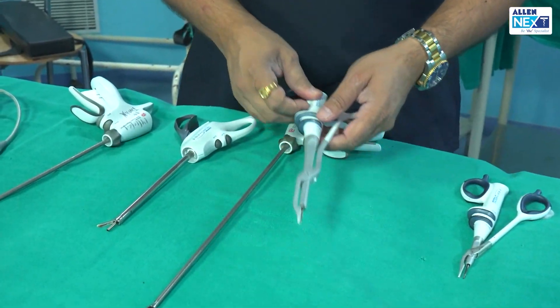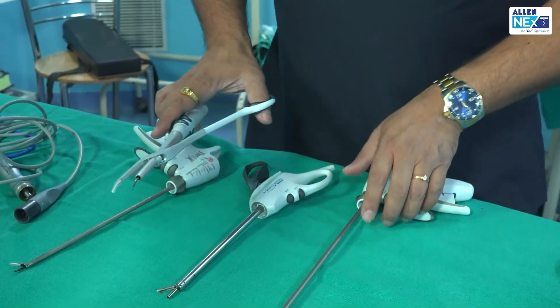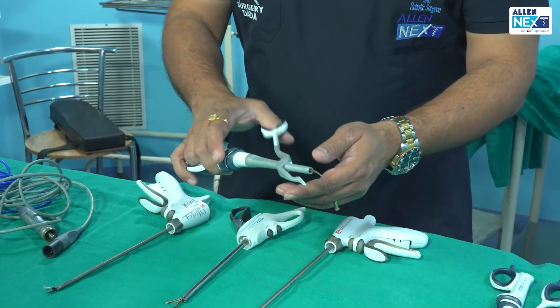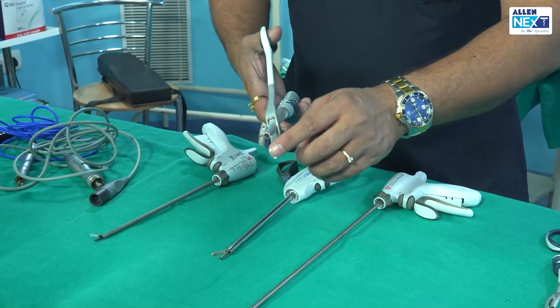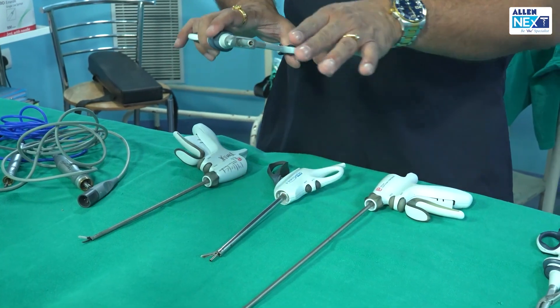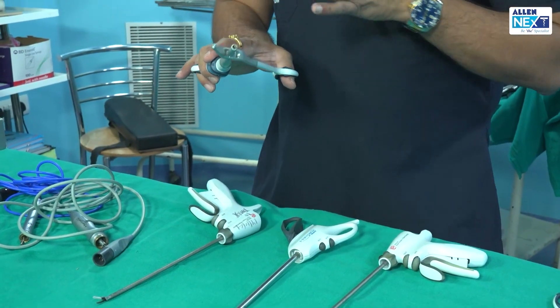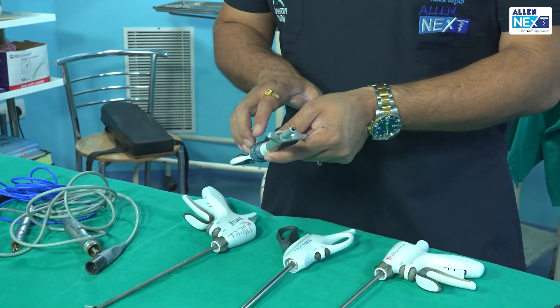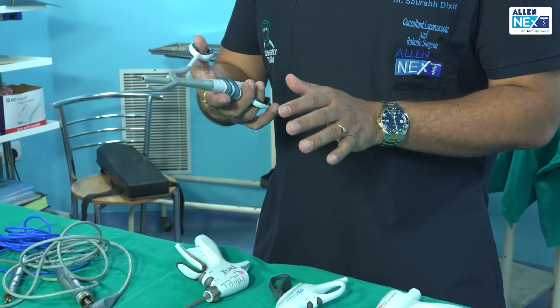This is again a harmonic — how you identify it: this is the metal jaw and this is the classical Teflon jaw. Remember, many of you just look at the image and say this is a harmonic. The metal piezoelectric jaw does forward-backward motions against the Teflon jaw.